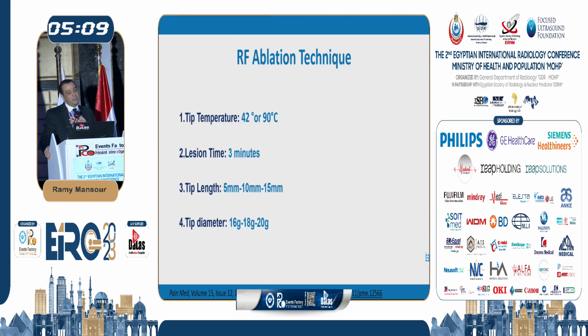So in Oxford, where I practice, this is our routine. This is what we agreed as our routine dose, or RF dose, depending on whether we're going to do RF pulsed or lesional.